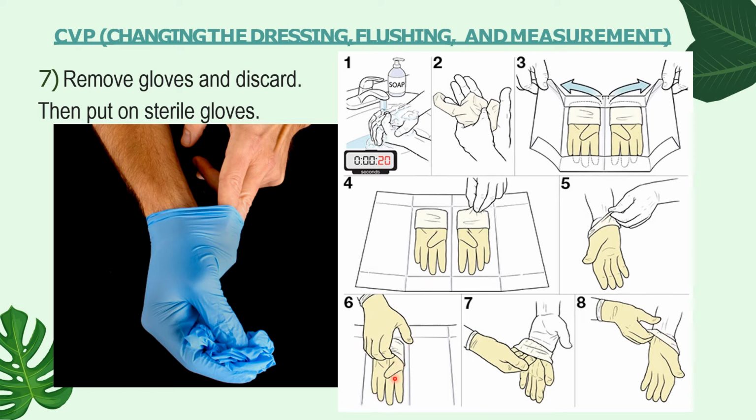Okay, so you can now use your, for example, this is the right hand because this is the left glove. This time your gloved hand must be touching the sterile part. So this technique is known as glove to glove technique. Okay, skin to skin, and this time is glove to glove technique. You are only holding the inside part. As you can see in number 7, you have to avoid this colored part touching your skin.